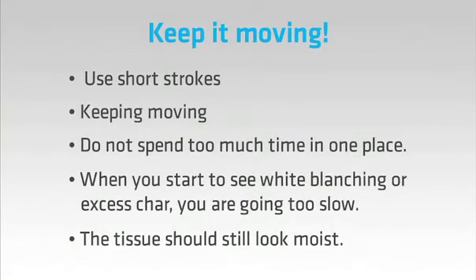When using the diode laser for surgery, use short strokes and keep the tip moving constantly. Don't spend too much time in one place or you'll get collateral injury. First is coagulation, which looks white, and if you stay still long enough, black from charring and carbonization. So look at what the laser is doing to the target and keep your speed to around 1 millimeter per second. At the end of the surgery, the tissue should still look moist, and the laser cut surface should look brown, like it has a great suntan.